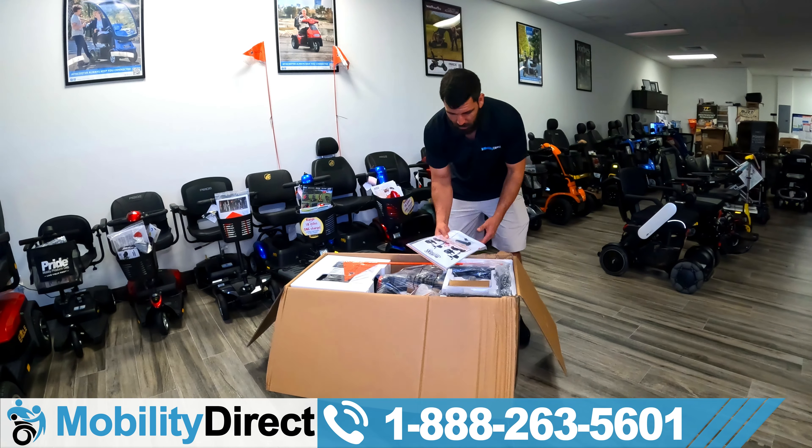So I just pulled out the first armrest — I'm going to go ahead and take the wrapper off. I'll put both armrests to the side for now and continue to unpackage everything, putting all my styrofoam pieces and cardboard pieces to the side so we can clean up the set afterwards. Here is the charger — it's a small charger. You want to make sure you charge your batteries for at least 8 to 12 hours when you first get your unit to train the batteries, give them that initial training charge. Keep in mind, the first few times that you use it, the batteries aren't going to last as long as they will after you break it in.